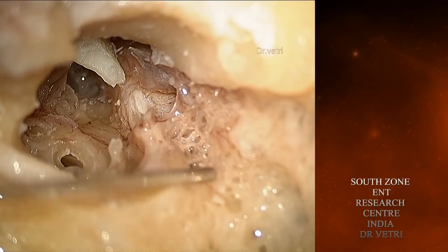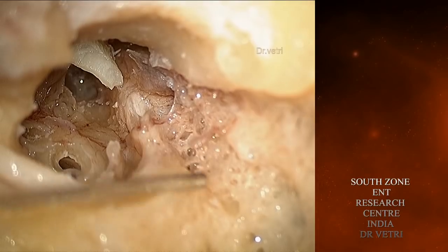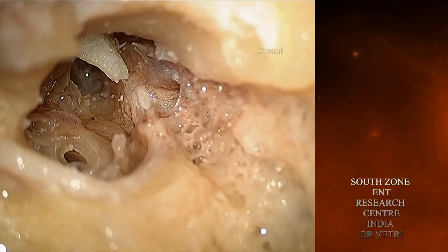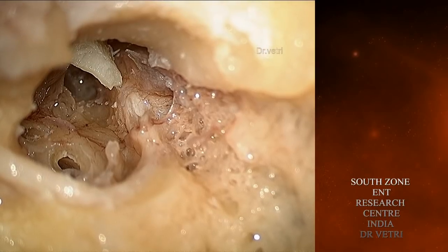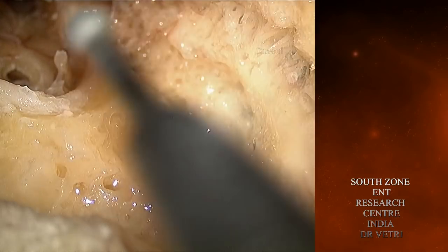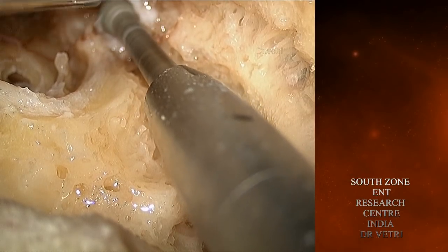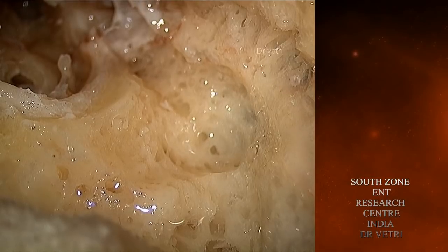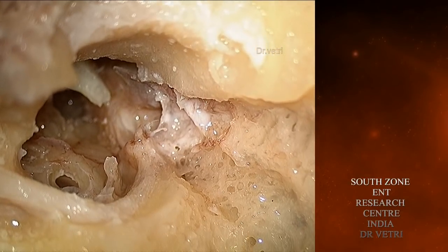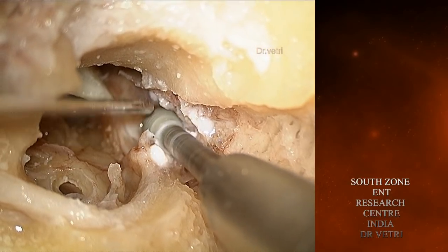The beautiful view of the processus cochleariformis. The full course of the horizontal portion of the facial nerve. You can see the small cells in the attic. You have got the labyrinth, so these could be called the perilabyrinthine cells. Now the small cells in the tegmen tympani.